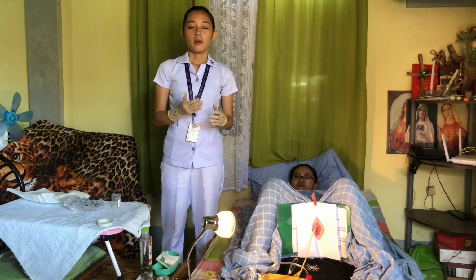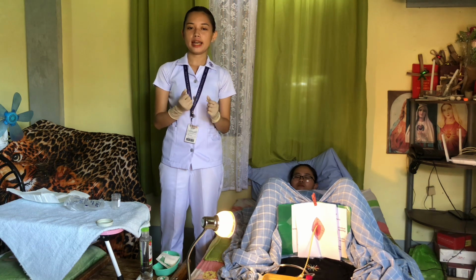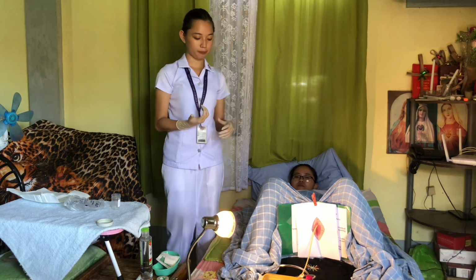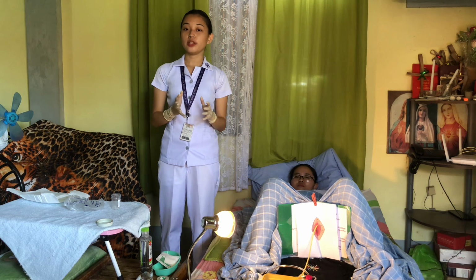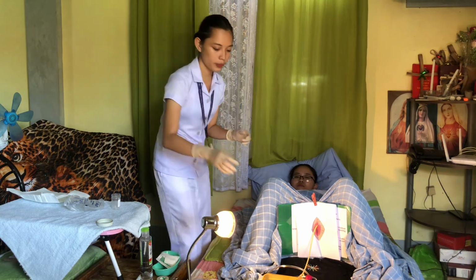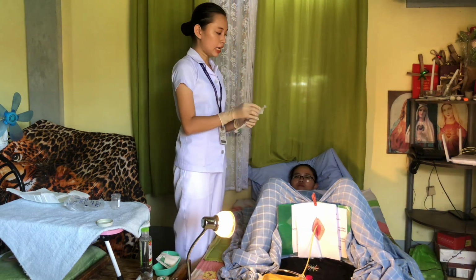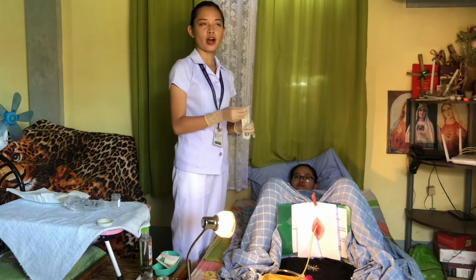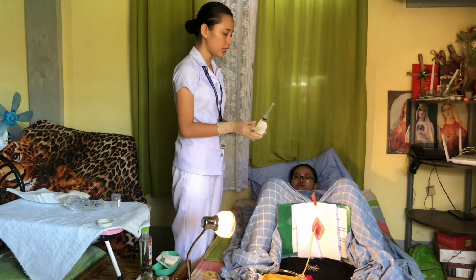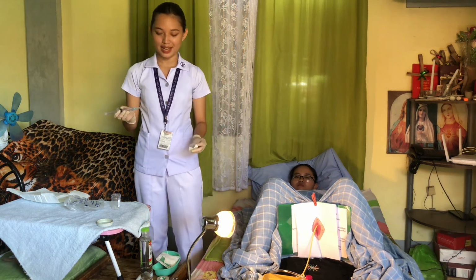So we must make sure that the urine bag is closed to avoid leakage and maintain the sterility of the connection. Next thing to do is to inflate the balloon with 10 to 15 cc of sterile water. So here we have our sterile water. So the balloon will prevent the catheter from slipping out of the patient's body. Also, when the catheter needs to be removed, then the balloon will be deflated.